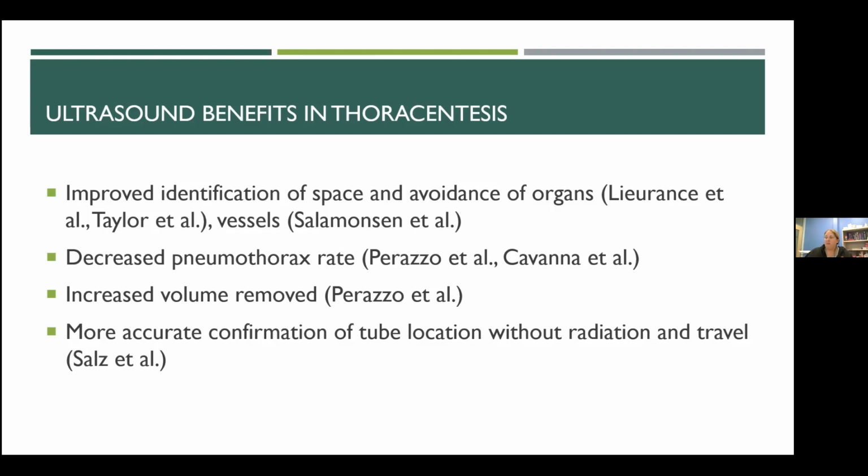And there was more accurate confirmation of the tube location, and they didn't have to wait for chest x-ray, and they didn't have to travel for things like fluoroscopy for repositioning of their lines, which is a huge time saver and patient safety factor. You finally have your dressing on, you're not having to wait for somebody to come x-ray it and then potentially readjust your tube, and you don't have to take the patient off the unit if not necessary.